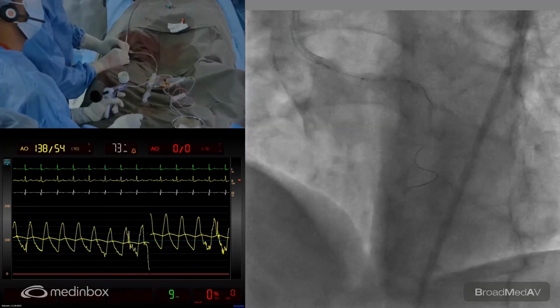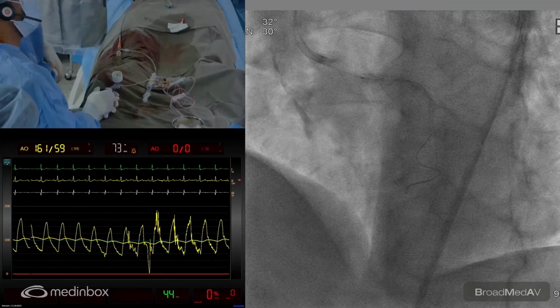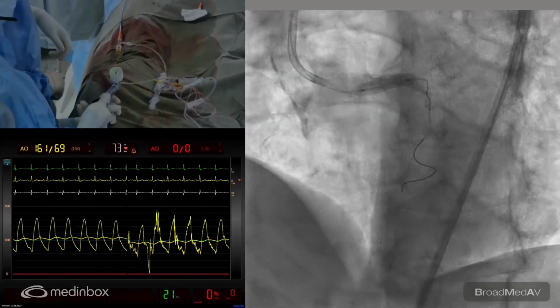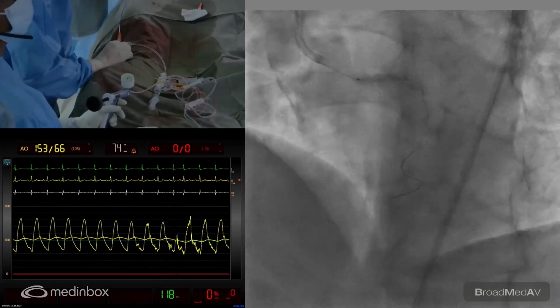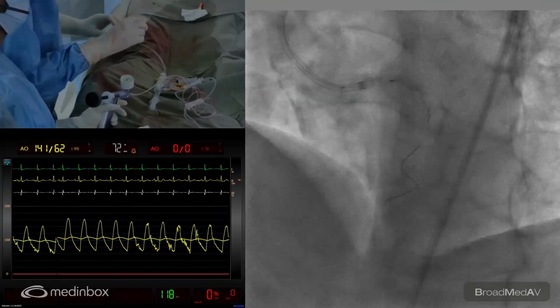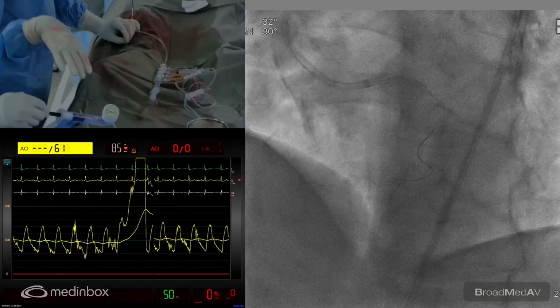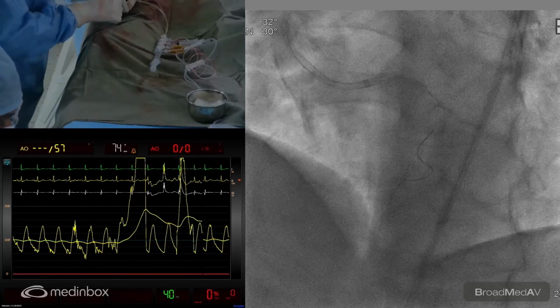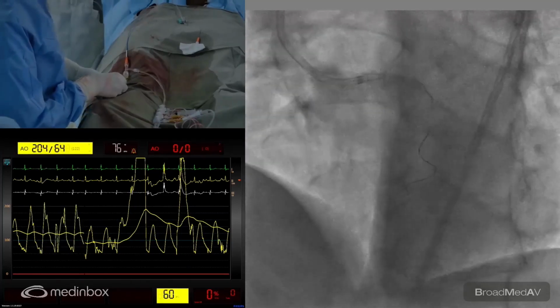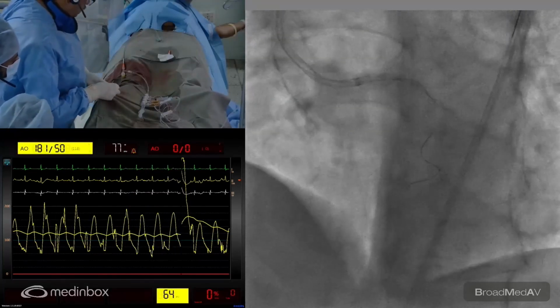Okay. So we'll now just flare it a bit. I'm pulling it back. Flare that, please. 4, 6, 8, 9, 10, 11, 12, 13, 14, 15. Deflate. And now we'll get the guiding slowly over the balloon into the stent and then release the stent out. Okay, ready for the IVUS system. We'll take a shot now down and then Nanda will take an IVUS picture.